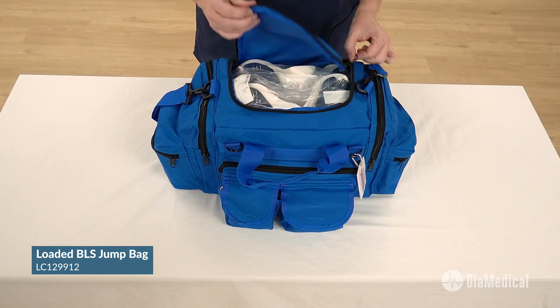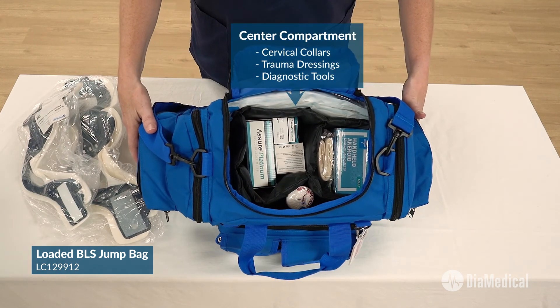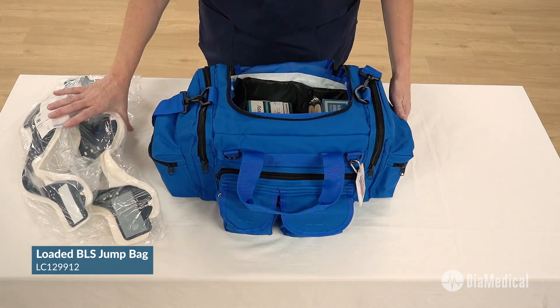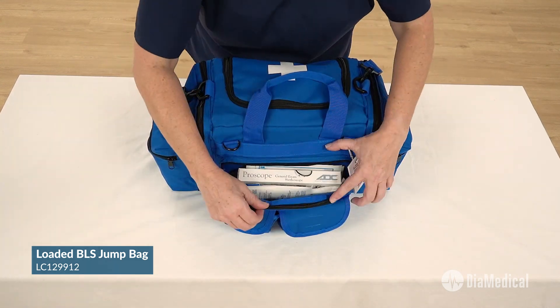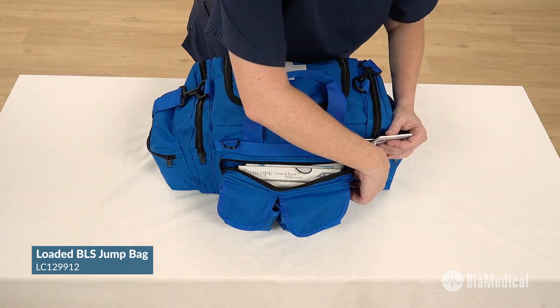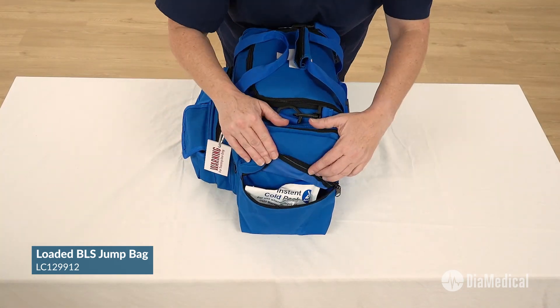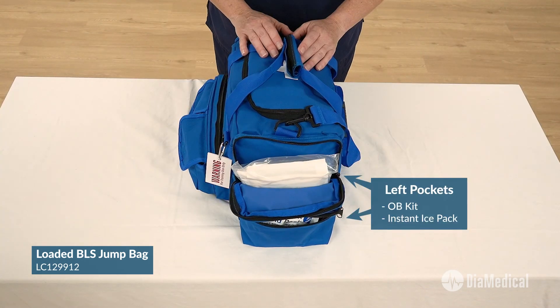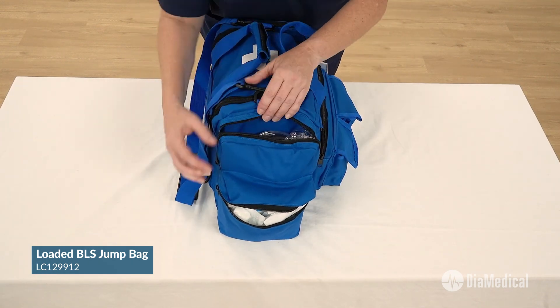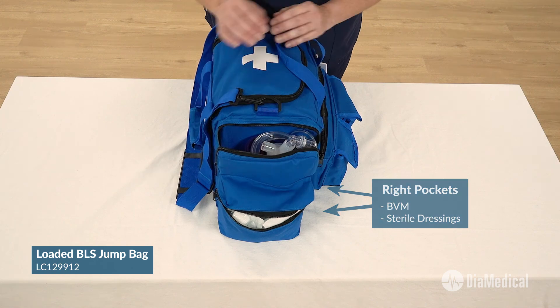The center compartment contains cervical collars and trauma dressings along with pocket diagnostic tools. The front pockets hold EMS pocket tools and airways for assisted ventilation. The left side pockets contain an OB kit and an instant ice pack, while the right side pockets contain the BVM and sterile dressings.